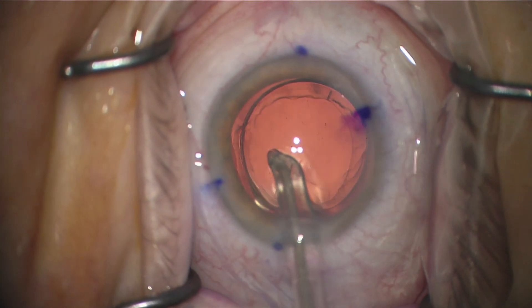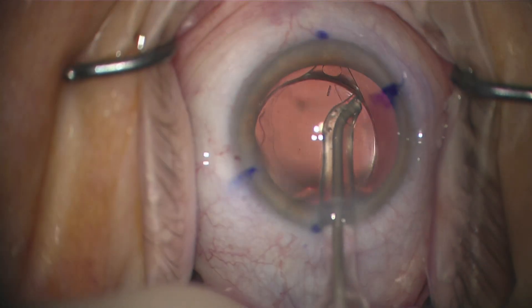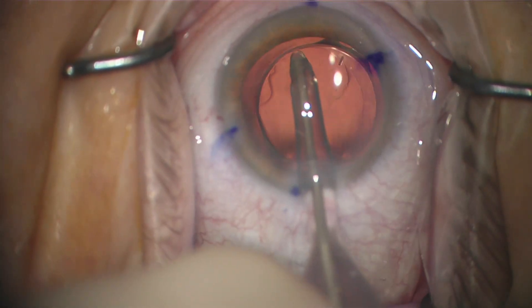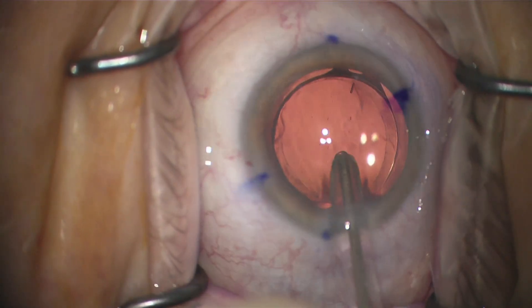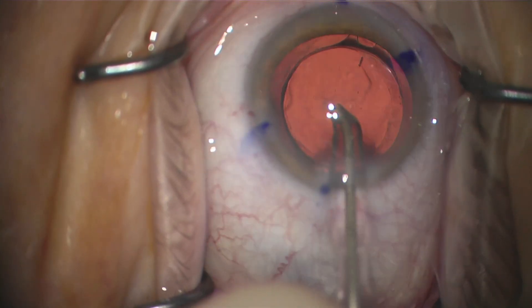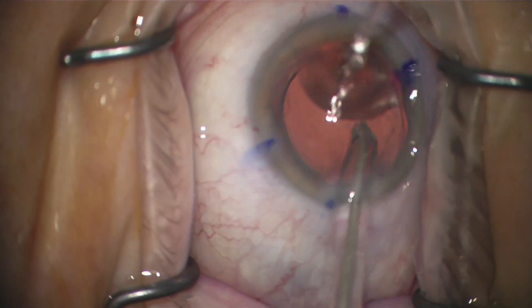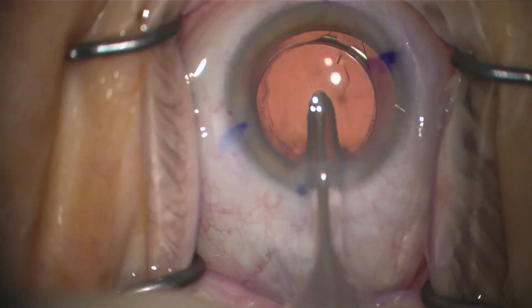Hi, this is Austin Nakatsuka and what I'm demonstrating here is a really quick and efficient way to rotate a toric astigmatism lens, or any lens for that matter, with the IA (irrigation aspiration) tip. First, I just want to show quickly what I've done — I'm aspirating out all of the viscoelastic, taking it all out so there's little to no viscoelastic left, and all that remains is fluid running through the irrigation aspiration.